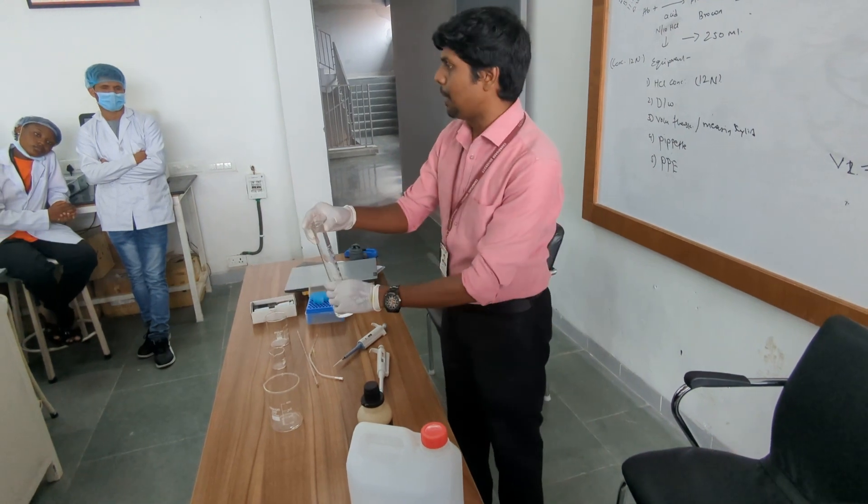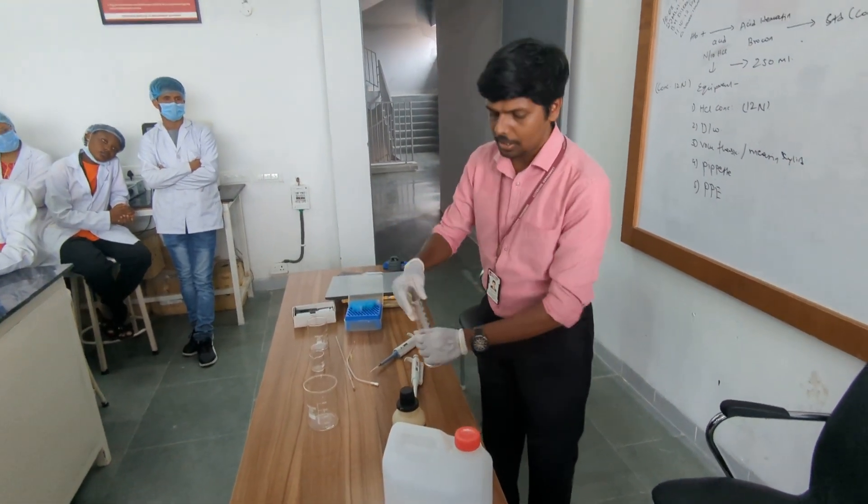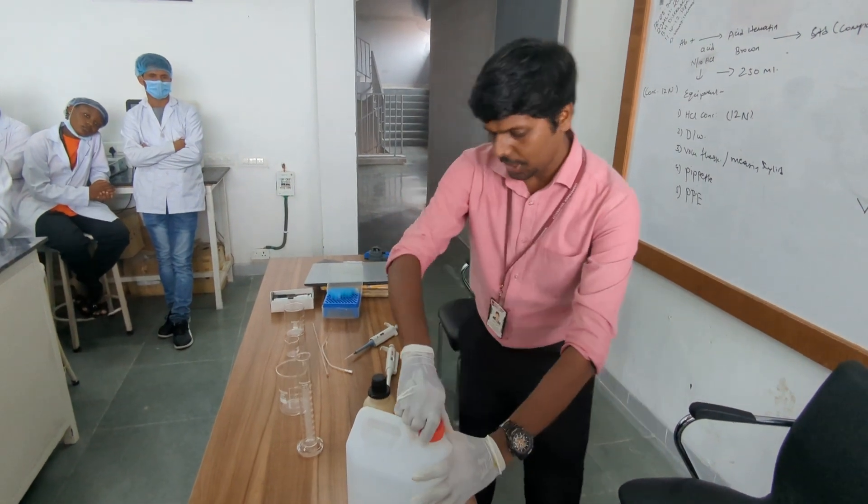First I will take 100 ml of distilled water into this beaker. Then I will add more water.